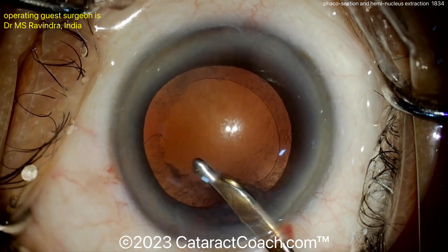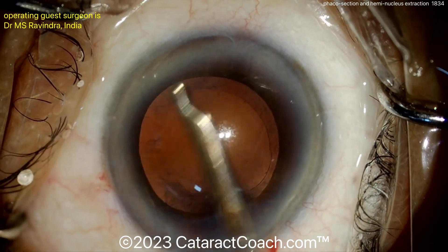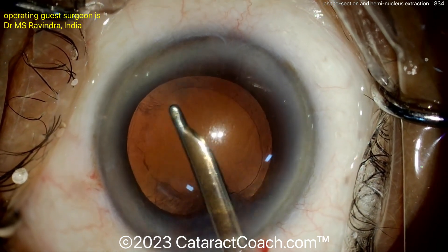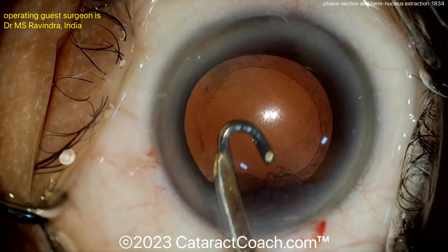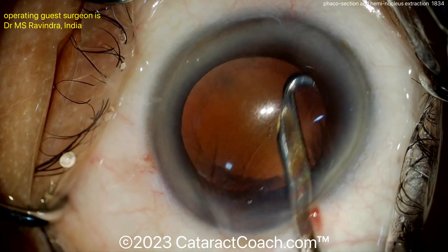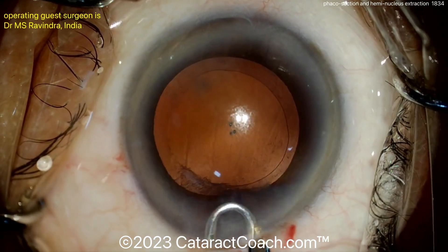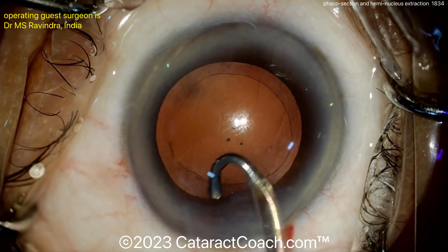It's a nice technique. I like this idea of a phaco section to split the nucleus into two halves. I may want to try this — in my own surgery center in Beverly Hills, maybe for a patient on whom I'm planning SICS. I'll still do a scleral tunnel and still do an SICS incision, but instead of making the SICS incision the full width as we normally do, maybe I'll make it smaller and try this phaco section in the anterior chamber in order to have a smaller overall incision size.